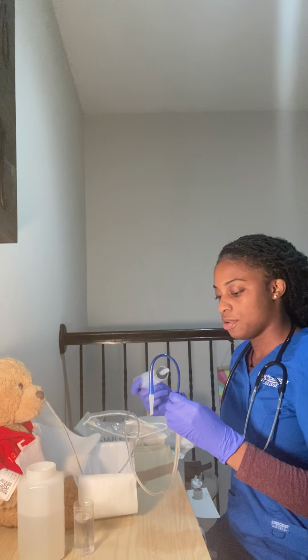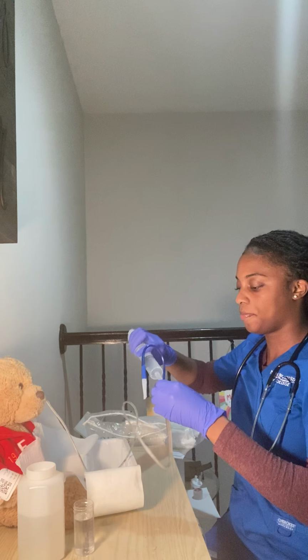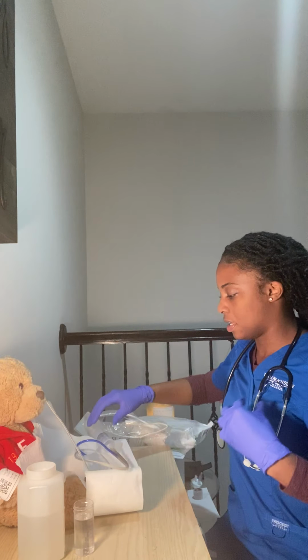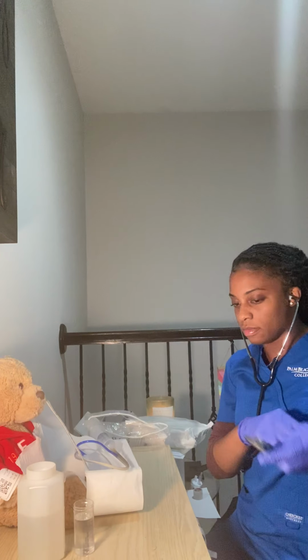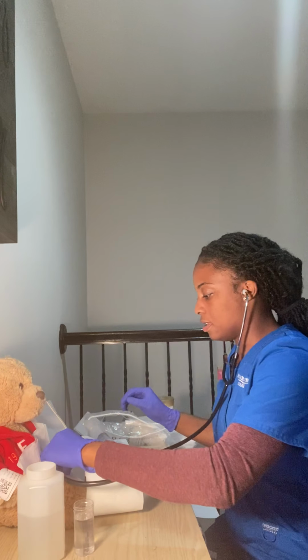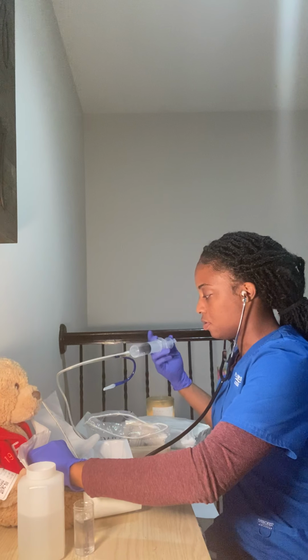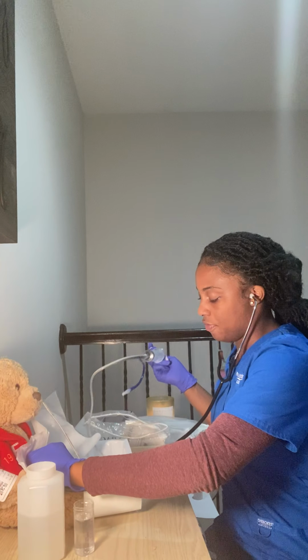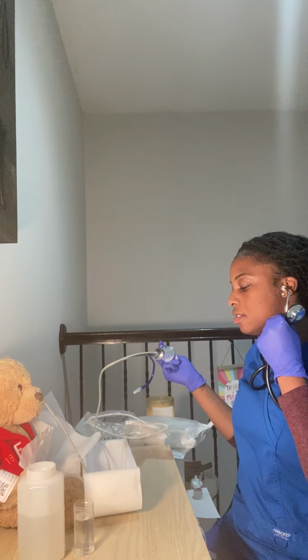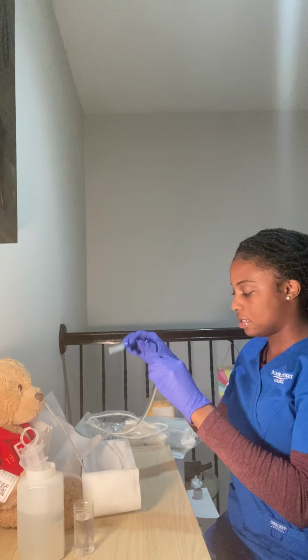Or I can also just go ahead and push in some air. And I can listen to the bowel sounds as I push in the air. So I'm gonna go ahead and do it that way as well. And then when I push in the air, I hear that it's in the stomach. So I can go ahead and remove that and remove this.